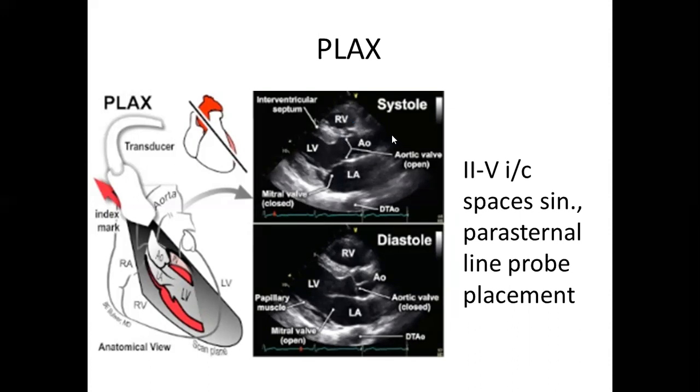So next is the left ventricle cavity, and right there you can see the aortic valve, which is open right now, and the aorta. Here on the right side, we are able to see the left atrium.